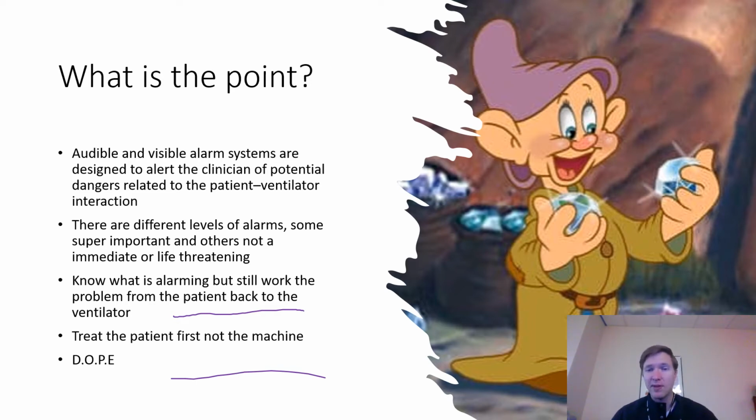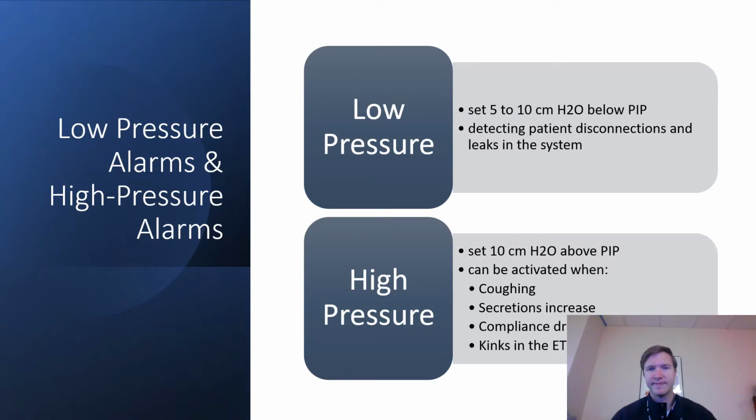So you go into the room, you're treating the patient first, right? Not the machine, right? I know in our world, we love to look at monitors. We have tons of monitors, tons of screens to look at. Look at your patient first. You're going to pick up a lot more, a lot quicker when you look at your patient first.